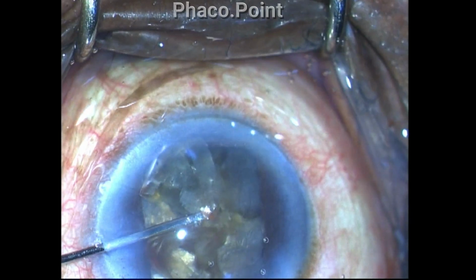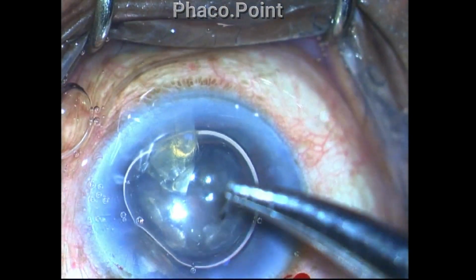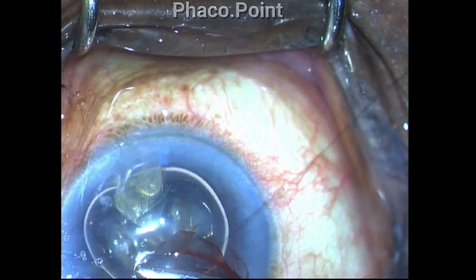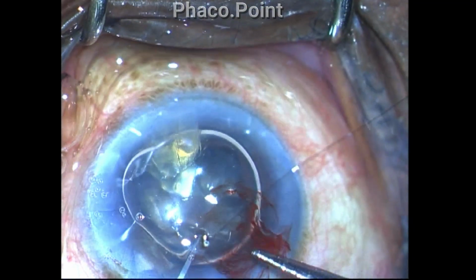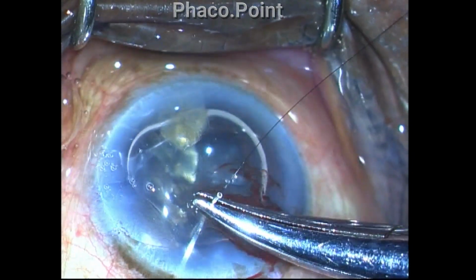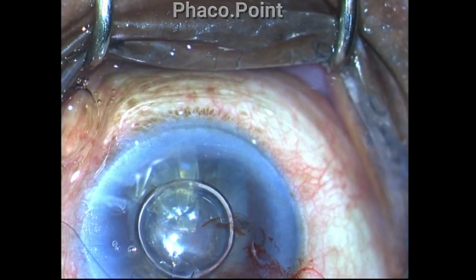I put in air at this point, and I think that I will take restraining sutures through the cornea in order to keep this Descemet membrane in place. So I go through the air bubble knowing that the Descemet's would be attached at that point, pass it through the cornea, come out of the periphery. I angle the suture in such a way that it does not impede or pass through the clear corneal incision site. Of course, the right way to do it would be to pass it from the scleral end. I passed this to the corneal end, but I was able to tag on the Descemet membrane.